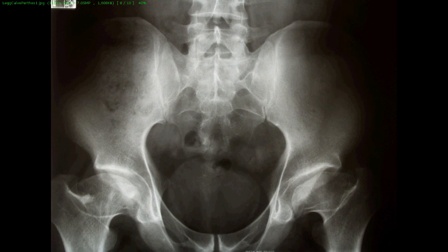The problem with this condition, if it's not found early and managed aggressively, is that you end up with the kind of changes that you see on this film. This young man is in for some precocious degenerative joint disease and likely will require hip replacement.